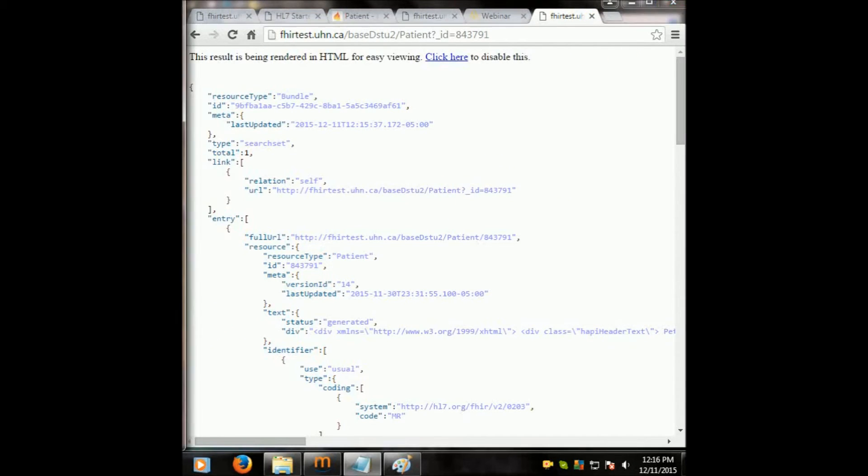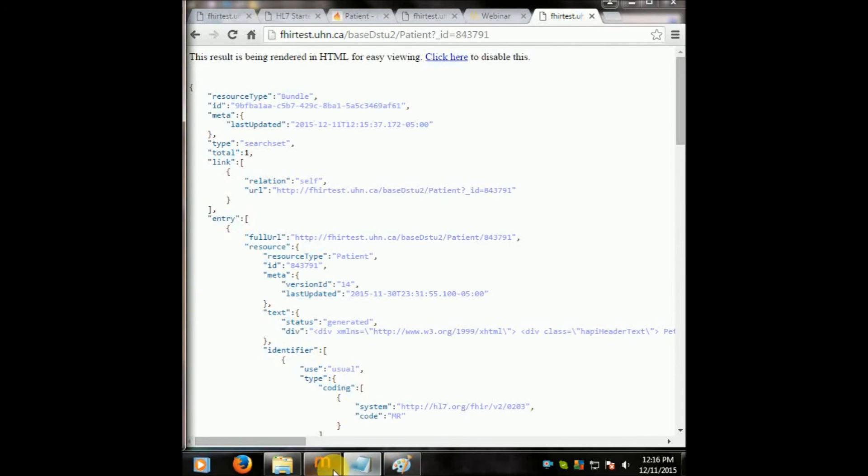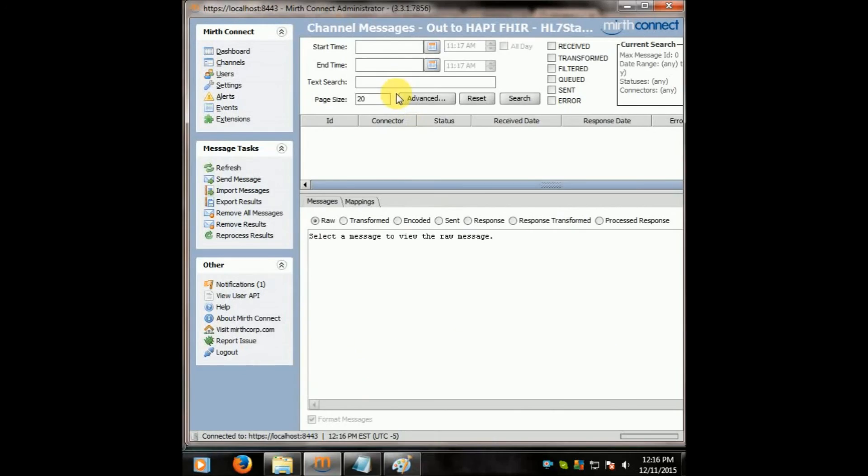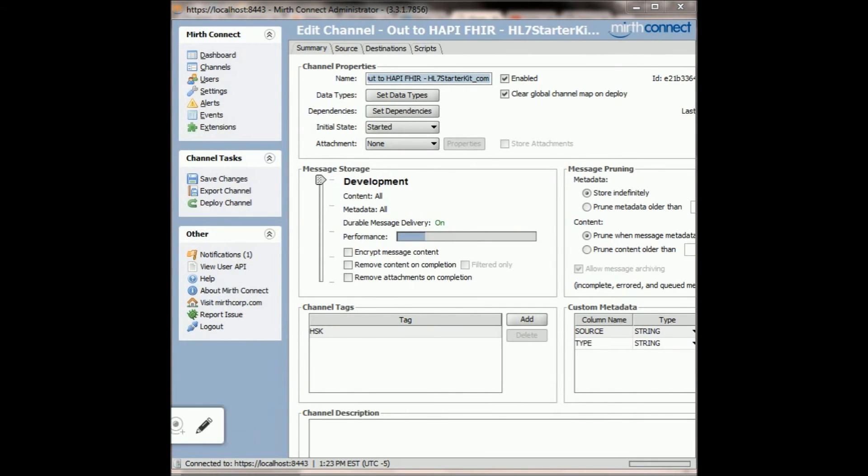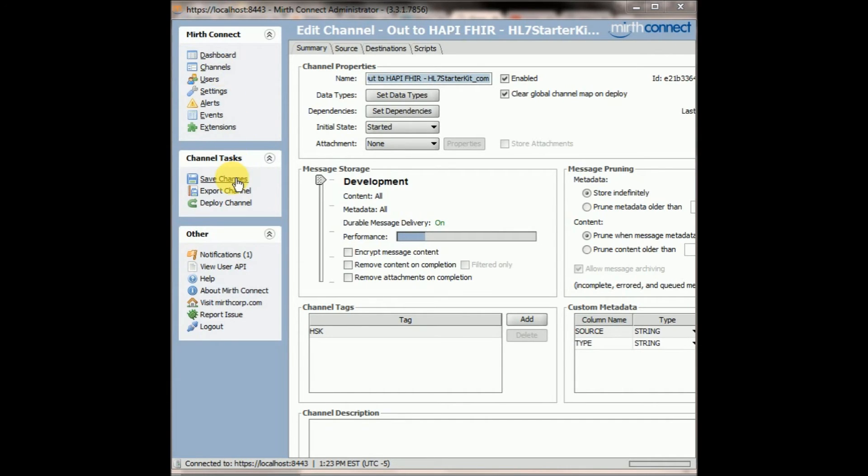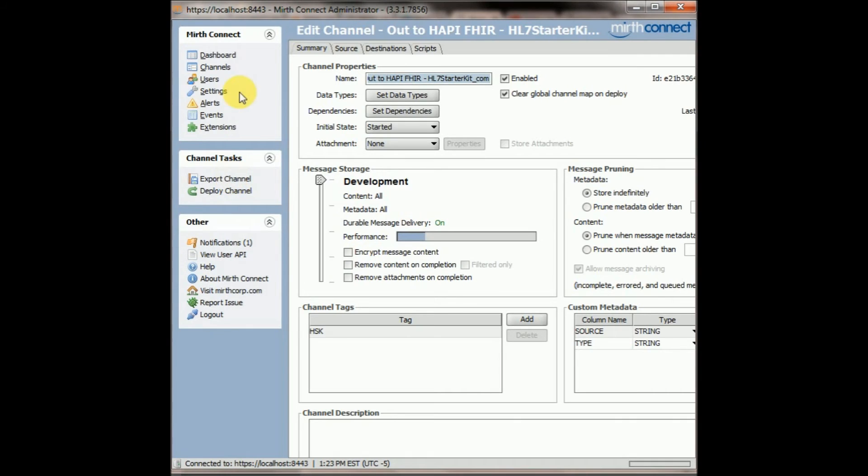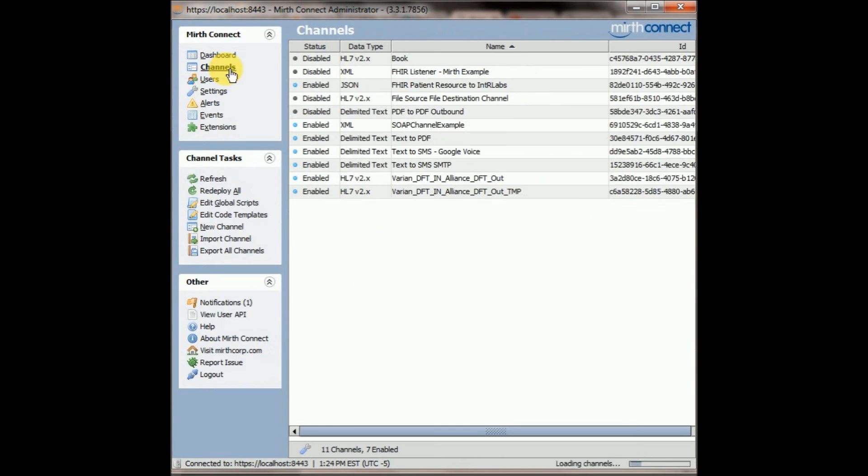All right, so that was step one. Step two, import the channel I created, which will do all the magic for you, import that into your Mirth 331. So let's go take a look to your Mirth 331. So import the channel, grab the channel and import it. I just did that and click save.